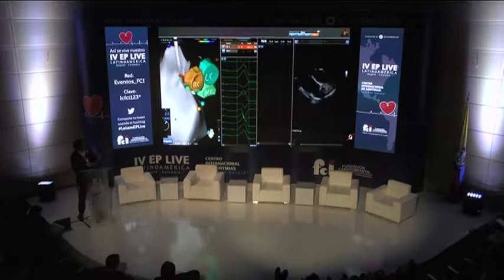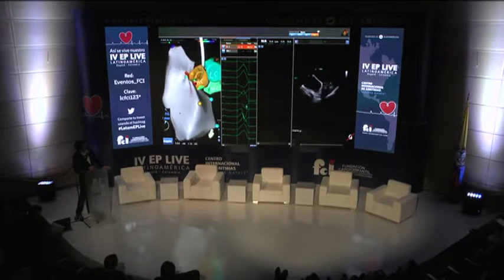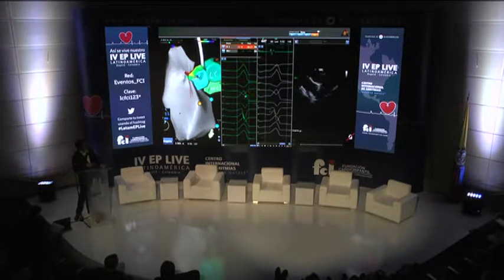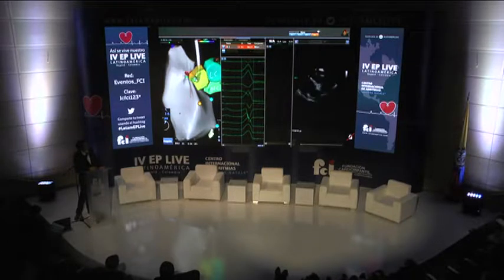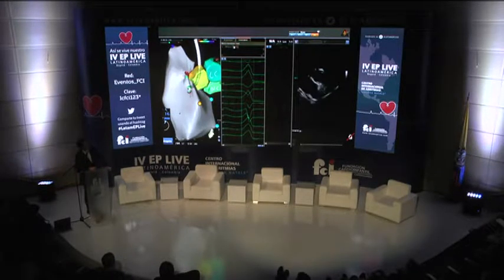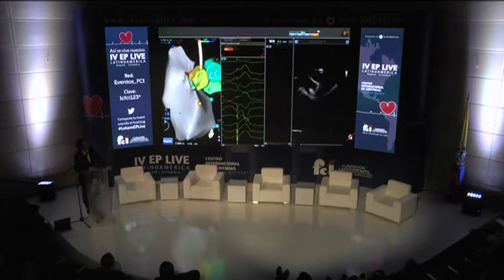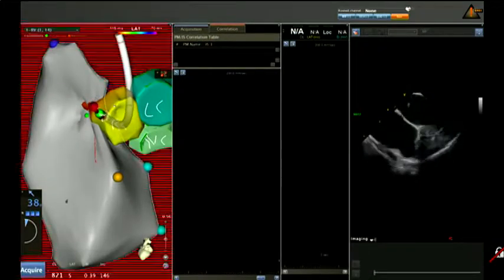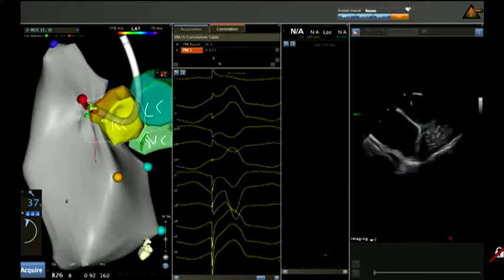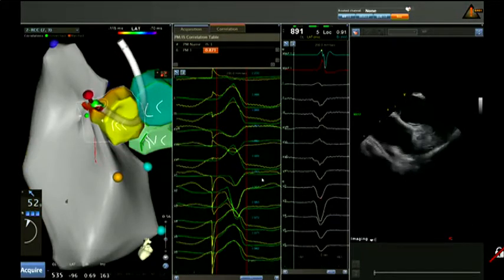Show us the PASO again. And let's see the comparative. So we take a template from the extrasystole. Can we see the PASO? Well, in fact, Luis, let me show you the way we use the PASO. We can do the PASO at this point so that you can see it now. Diego, take one PASO point. At this site, we are going to do a PASO and compare.